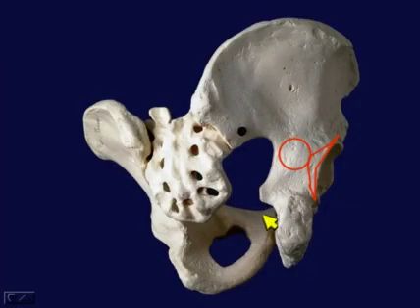If you look at that, therefore, you are approaching visually the right posterior hip in this individual.